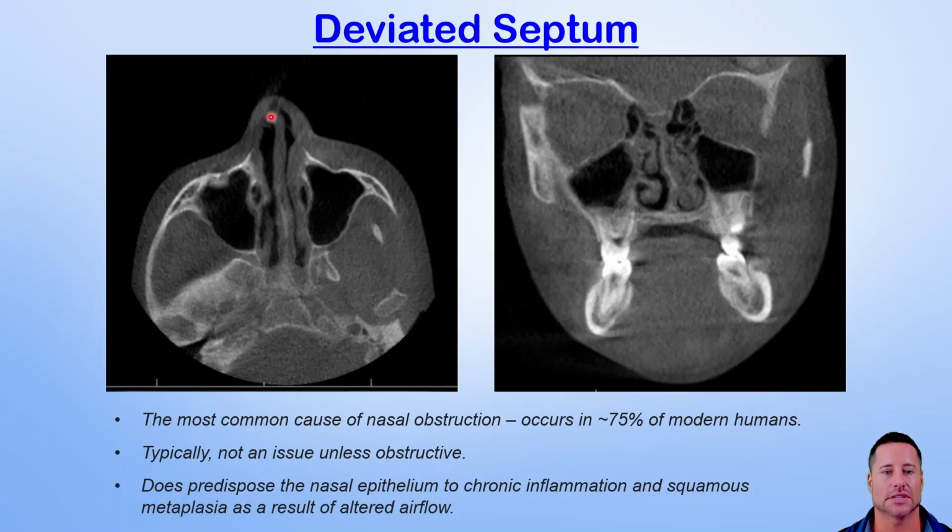So you can see here, looking at the septum, you can see where it deviates first actually to the patient's left, then back to the right, and then back a little bit to straighten out. And you can see the septum here going down and deviating over to the left and down. So again, able to appreciate this and just see that this patient is probably not breathing too well on the left side of their nose, probably breathing pretty well on the right.